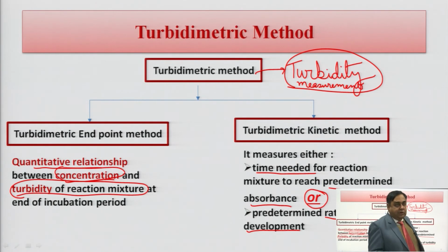If containing endotoxin, we can also tell the amount.